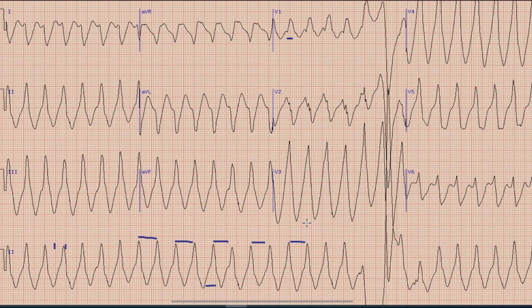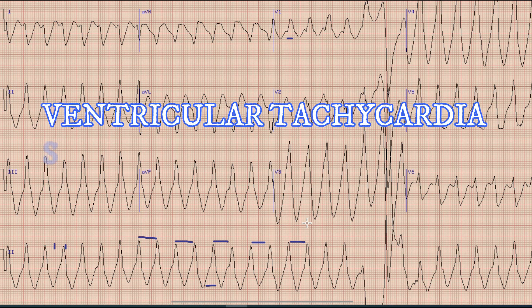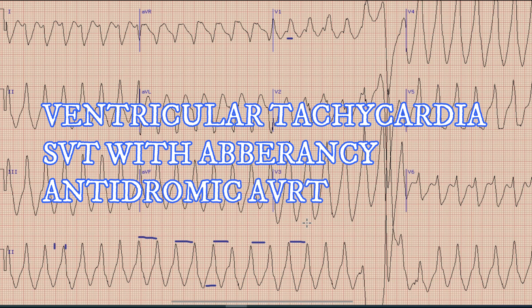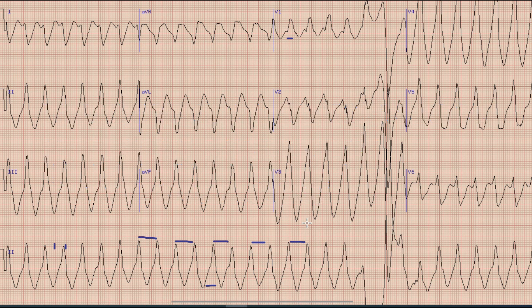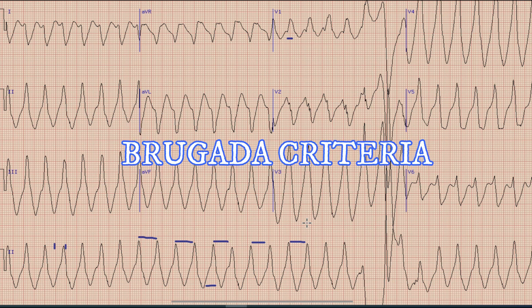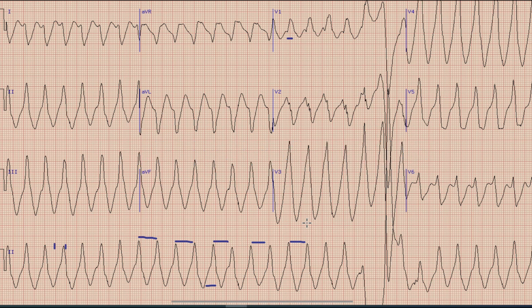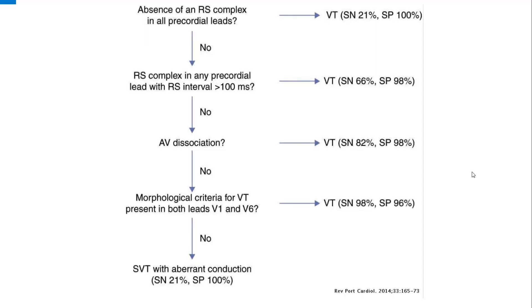So we can say that this is a broad complex regular tachycardia. There are three main differentials: first is ventricular tachycardia (VT); secondly, it could be SVT with aberrancy; and third is antidromic AVRT. To differentiate between ventricular tachycardia and these two types of supraventricular tachycardia, we apply a criteria called Brugada's criteria, which has around 90 to 95 percent sensitivity and specificity.